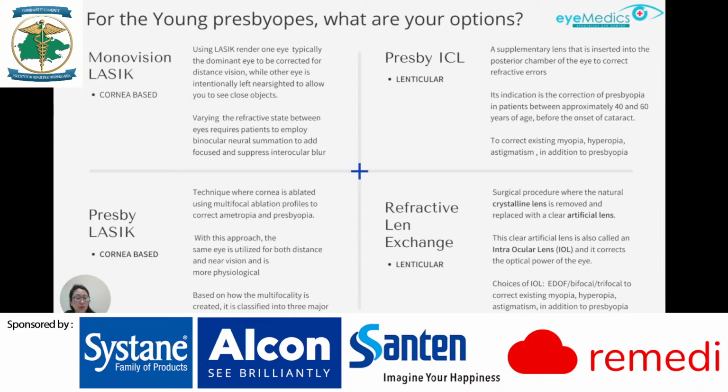One would be monovision LASIK, which is a cornea-based procedure, and presbyopic LASIK, which is also a cornea-based procedure, whereas other methods, which are more lenticular-based, would be presbyopic implantable contact lens or a refractive lens exchange.